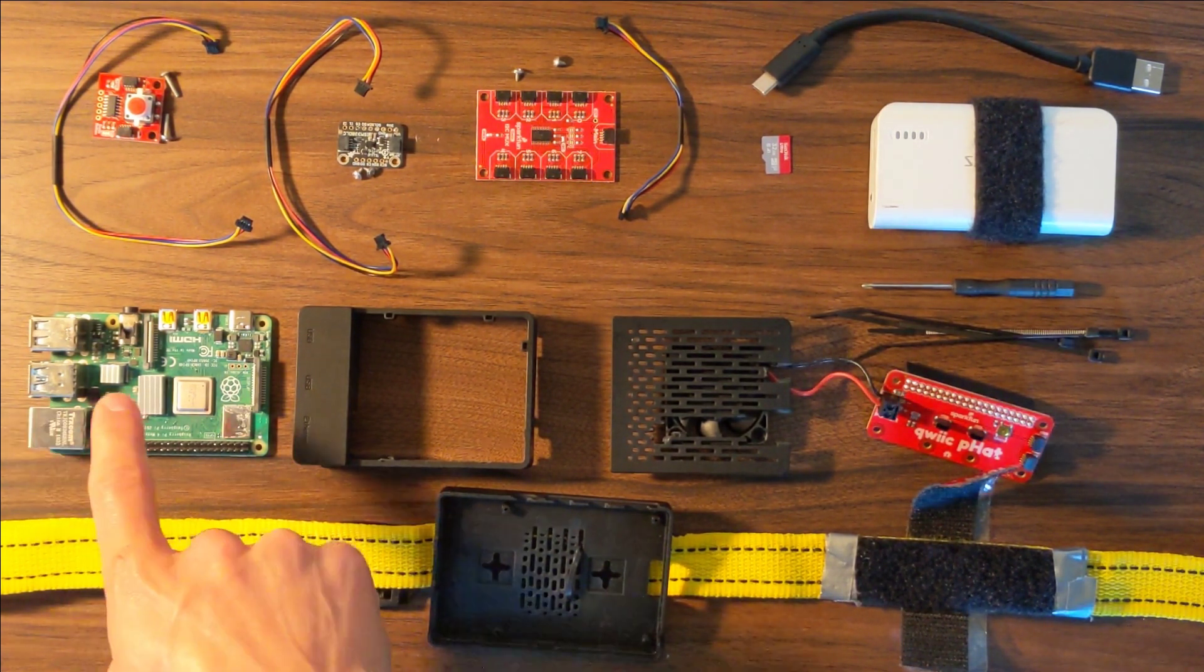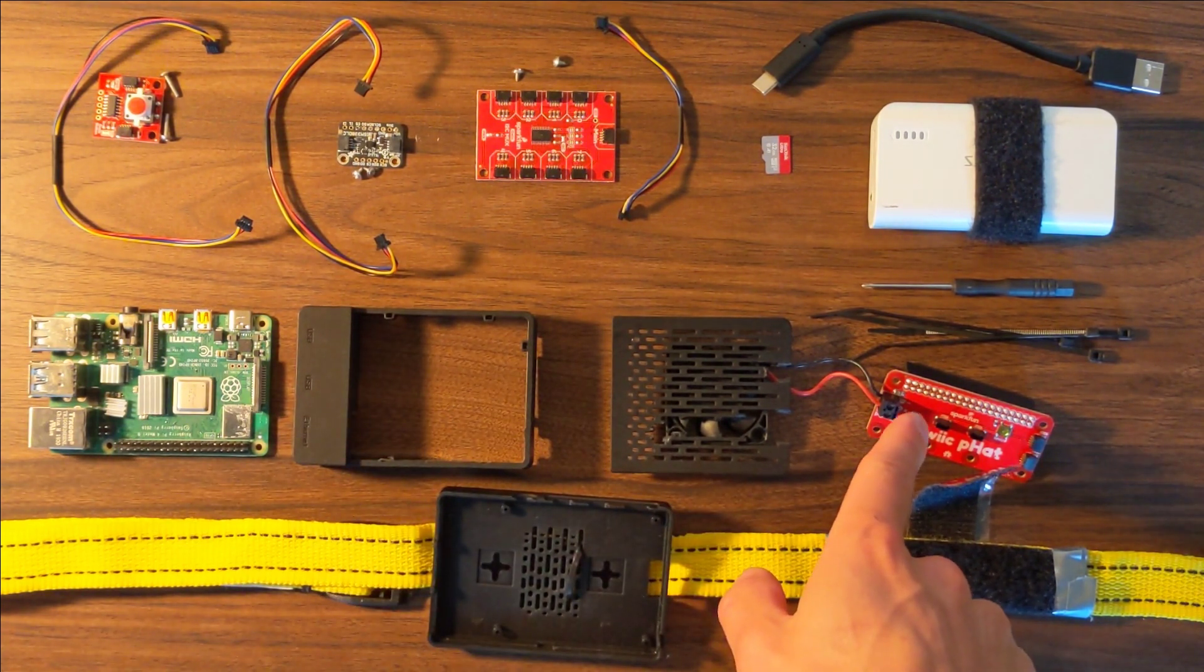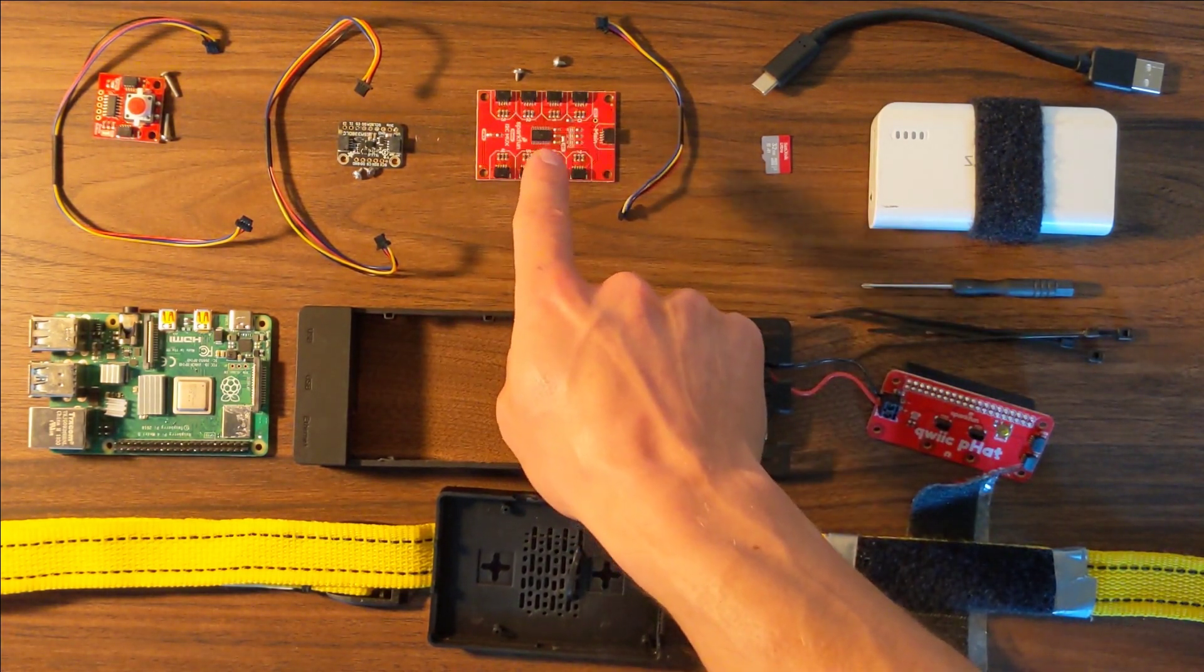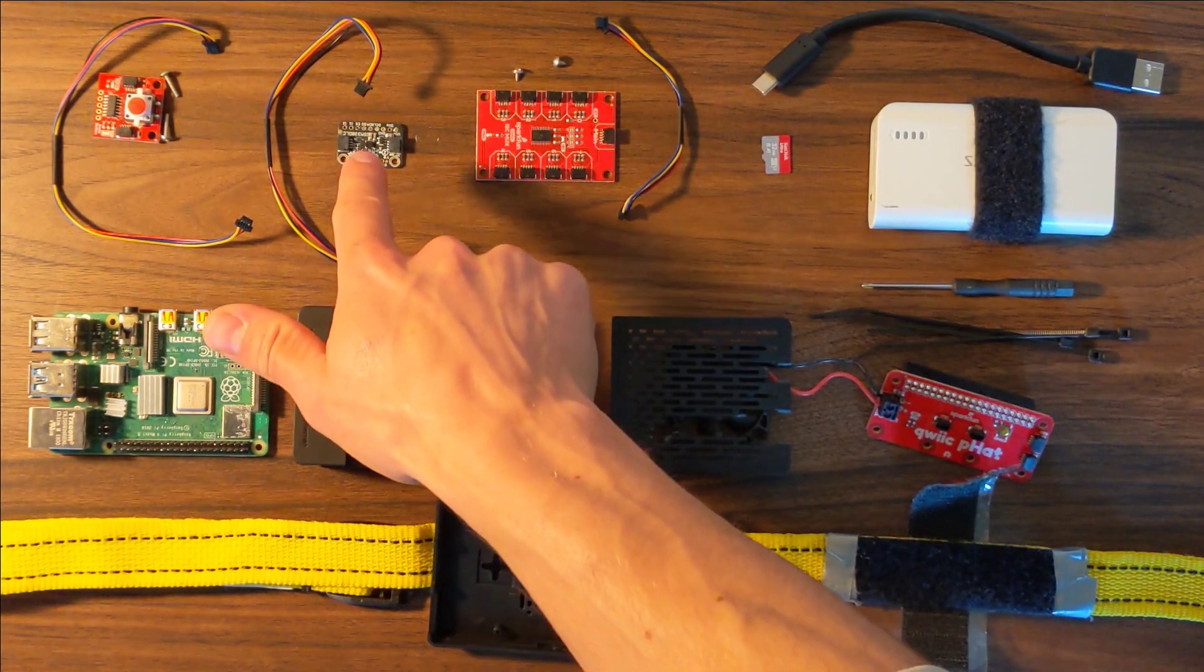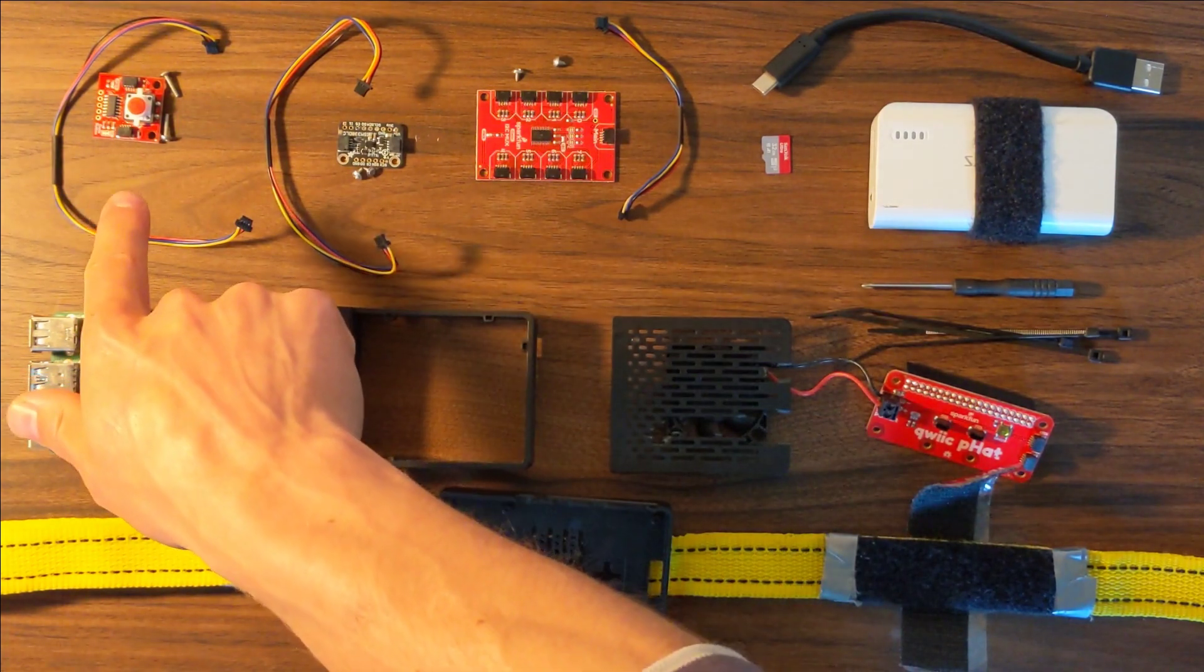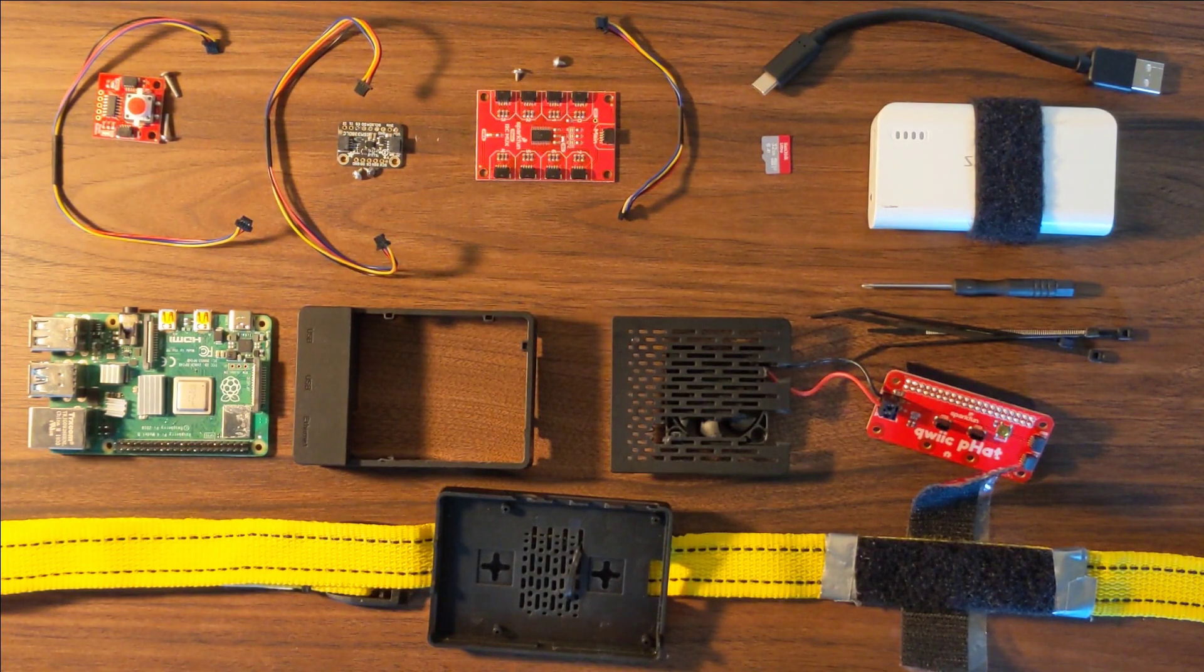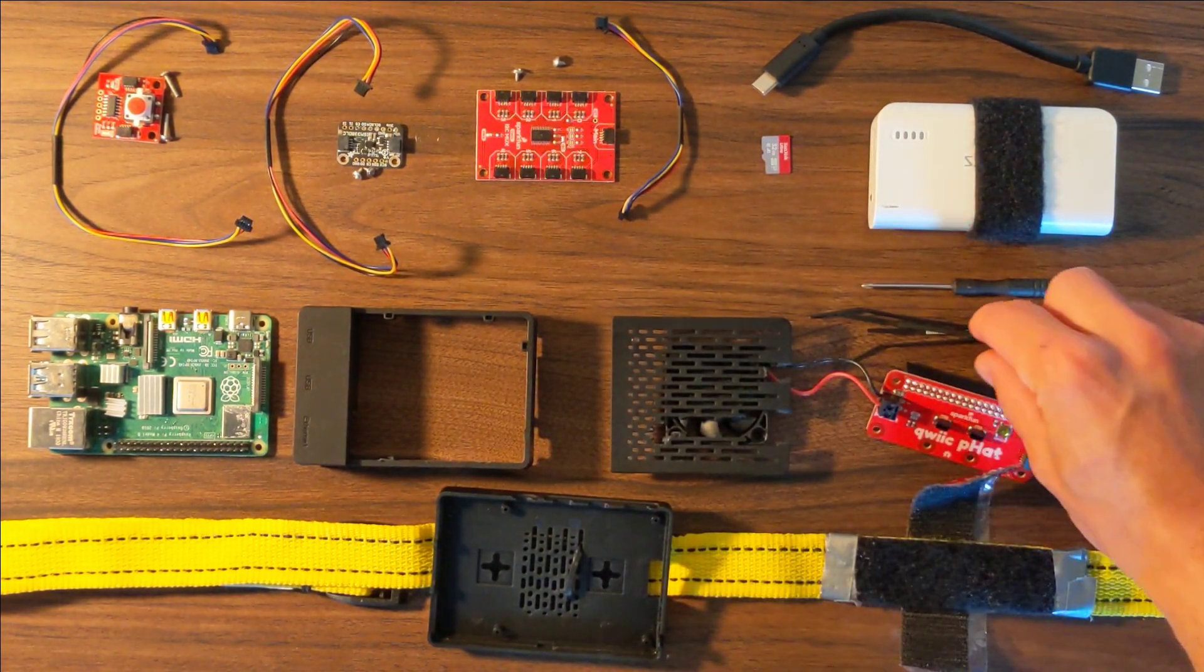Here I've unpacked the Raspberry Pi, the case, the quick connector which is how we'll connect the sensors to the Pi, this quick multiplexer which allows us to plug a bunch of different sensors in. One IMU which will be worn on the hip for your base orientation and a button LED which will allow you to start and stop recordings and also tell you when the device is actually recording or ready to record. And then we have our battery and our 32 gigabyte SD card.